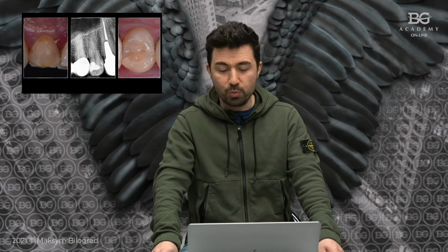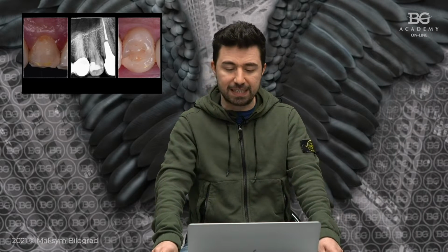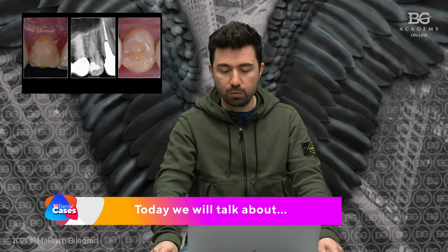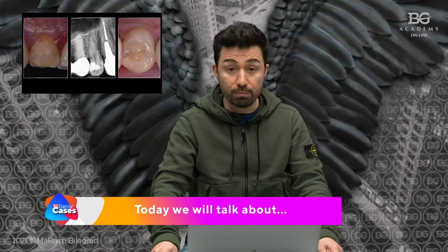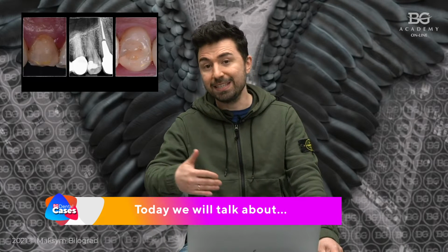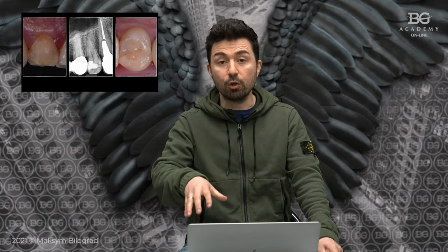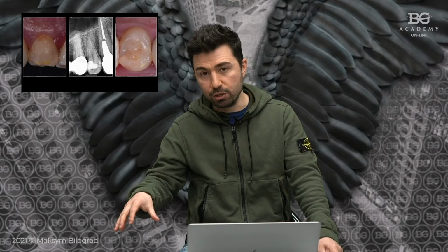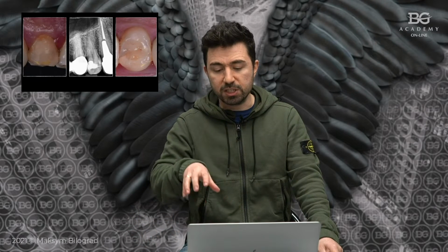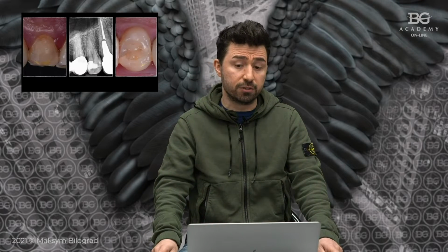Hello everyone, we are back on YouTube channel with our BG dental cases, and this time I'm going to present you very interesting clinical situation with step-by-step documented indirect restoration. The approach that we call restorative-driven endo, because from the very beginning we started with restorative part and then we went to the endodontic treatment.